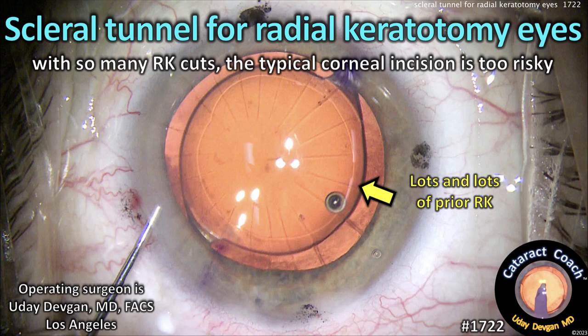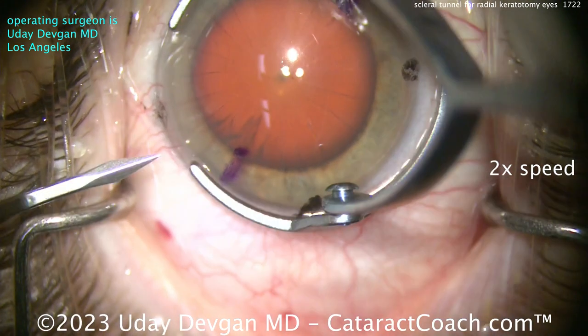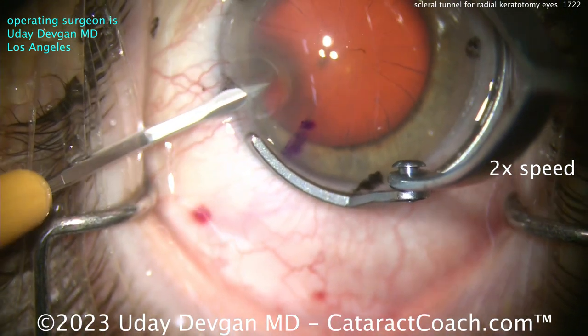CataractCoach.com — a scleral tunnel for radial keratotomy eyes. This patient has so many RK cuts that a typical corneal incision is simply too risky. Here's a case, start to finish — a complete cataract case.